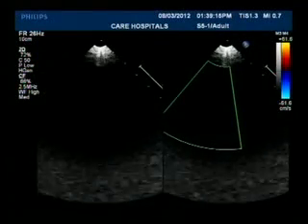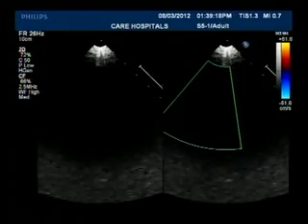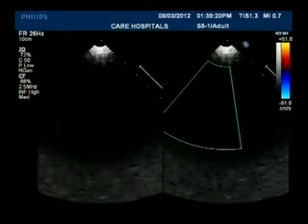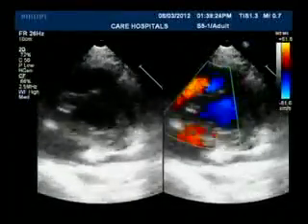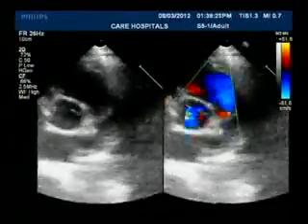All right, Sudeep, just go ahead for the echo. Color it, give me contrast. Are you going to release it now? No, I'll just perform a check angiogram here through the side arm of the sheath. How about TR?